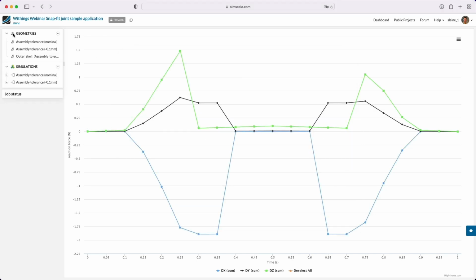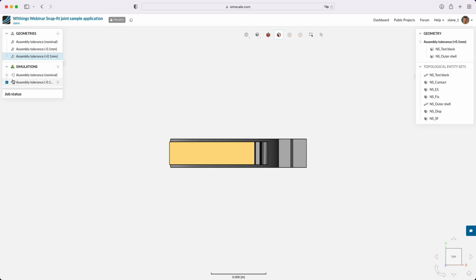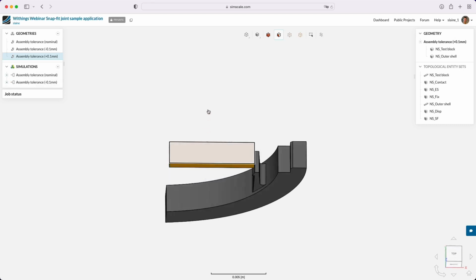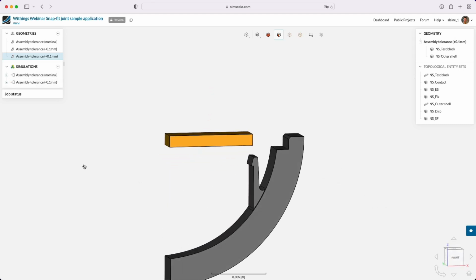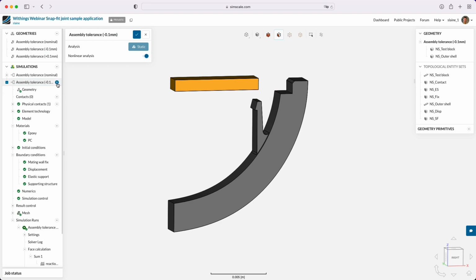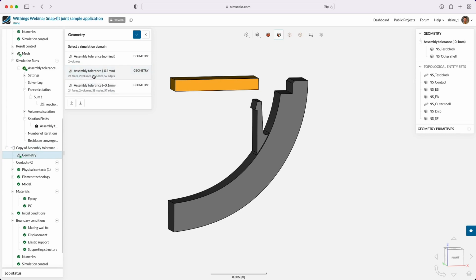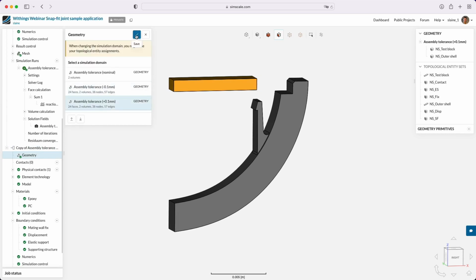Okay, so that's imported our geometry into SimScale. So up here now we see a third geometry, and I'll just tidy up the naming a bit here. So we've got our assembly tolerance plus 0.1. And we'll then be able to use this to set up another simulation. So the great thing about associativity between these CAD parts is we don't have to go through assigning everything again. We can take the minus 0.1 millimeter, use that as a template, and then swap out the geometry for the plus 0.1 millimeter case.